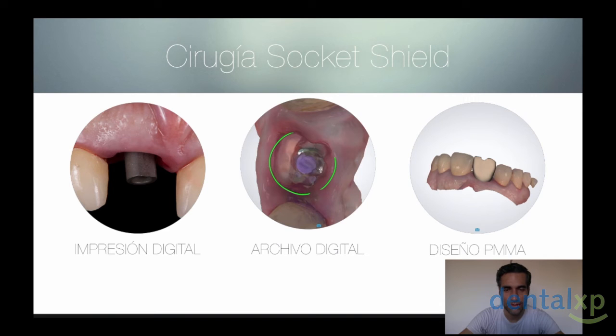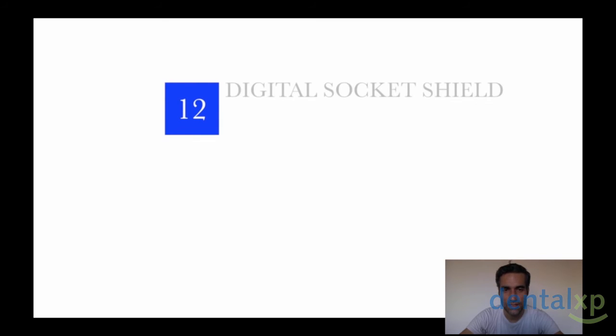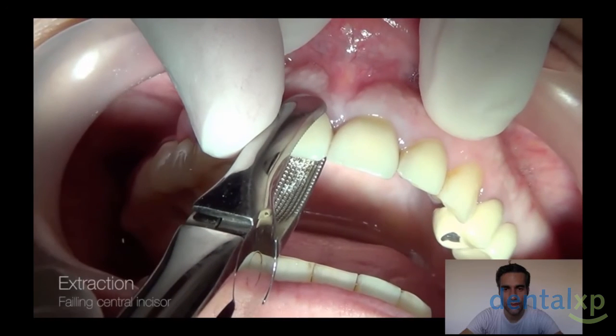This is something that digital gives us in this technique, and it is very, very important, because if you leave a contact between the fragment and the provisional or the definitive restoration, it can be a leakage zone for bacteria and for infections. This is another video of this case. You can see the whole video on YouTube. It's better you go there and see the whole video because it's a very large video, but we show how we did this case.